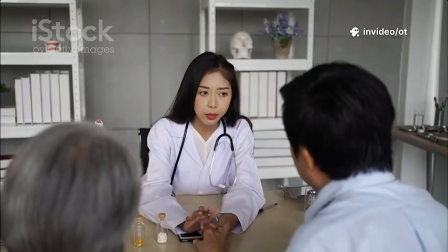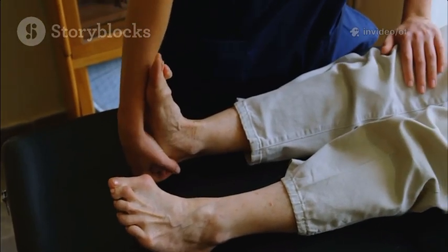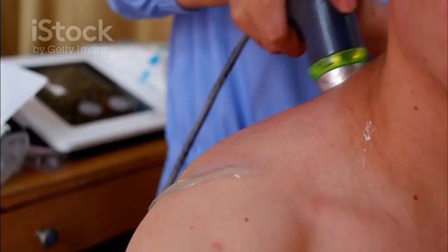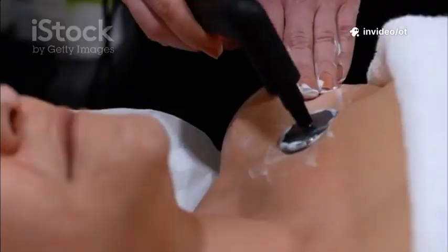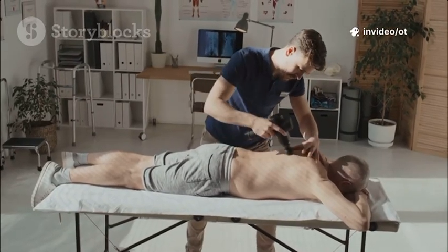Therapeutic modalities are cornerstone tools within the physical therapy profession. They serve as valuable adjuncts to our primary interventions of manual therapy, exercise, and patient education. Their primary function is to help manage critical symptoms like pain and swelling. These symptoms often act as barriers to a patient's functional progress.